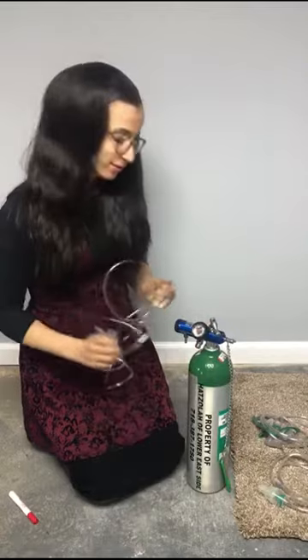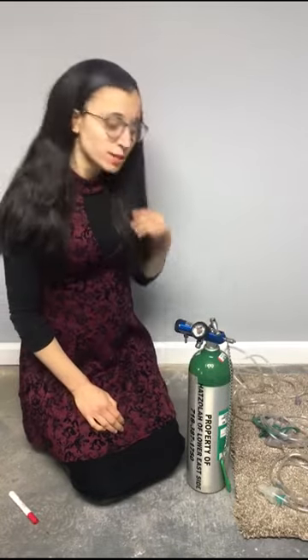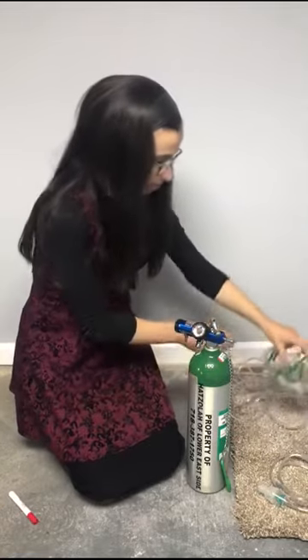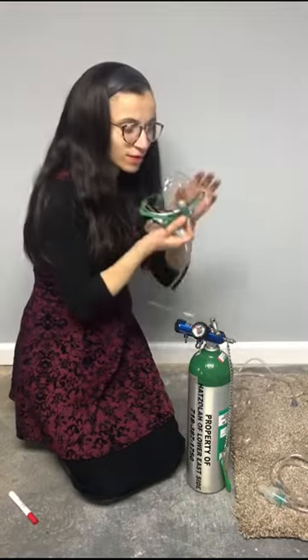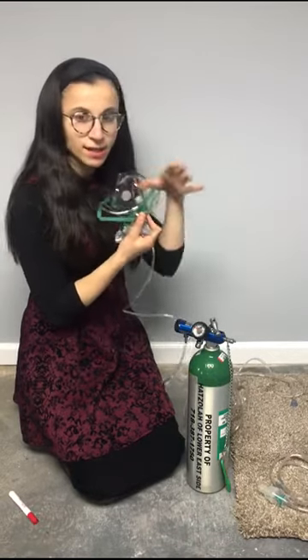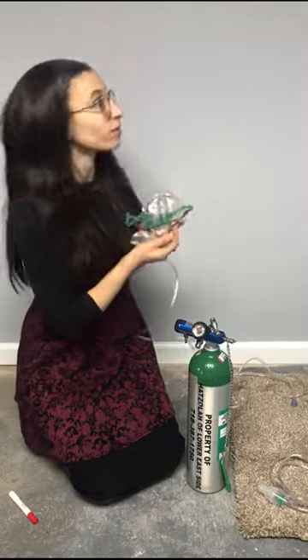The next one you're going to have is the simple face mask. I don't have that here, but just imagine something like this without the bag on the bottom. The face mask goes on, and they exhale through there. This goes around them, goes on the mask. Very simple.